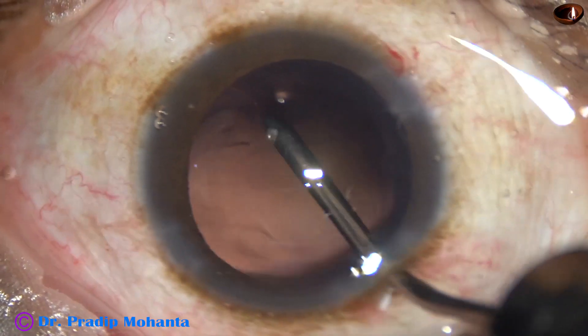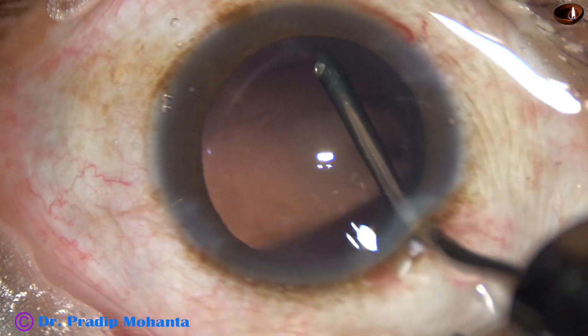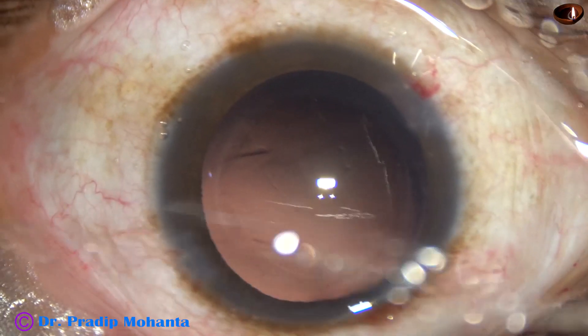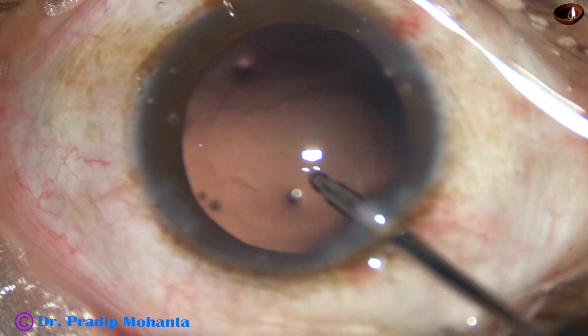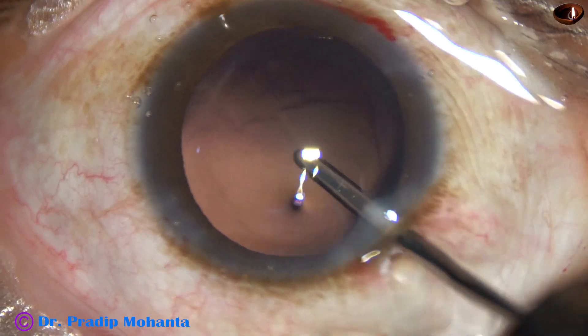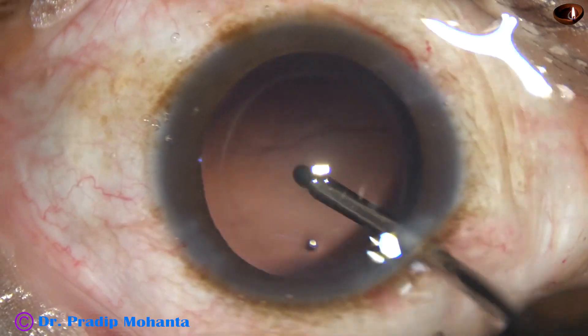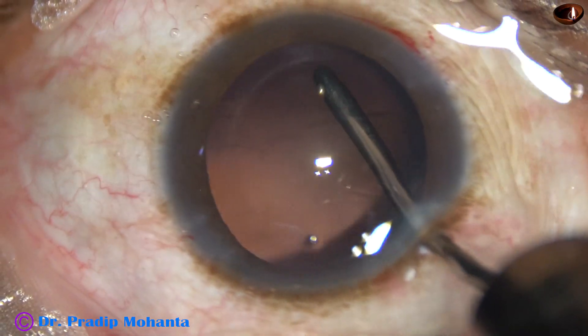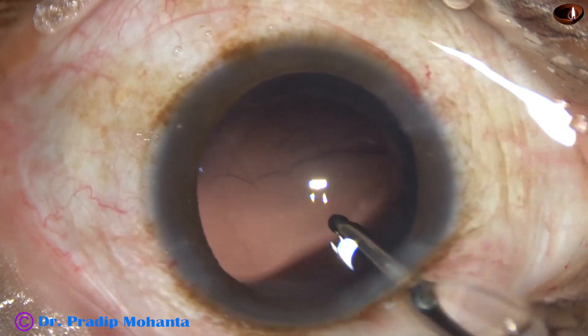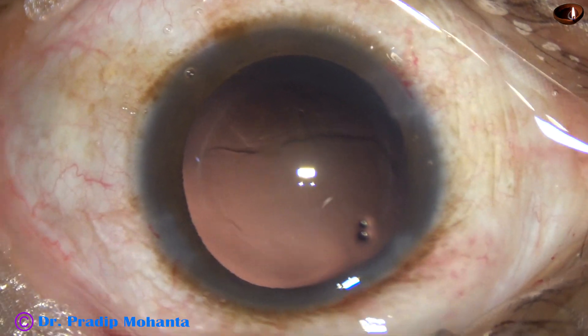Now I use the irrigation to hydro-polish the posterior capsule. Some lens fibers that are sticking to the posterior capsule are being dislodged by this maneuver.